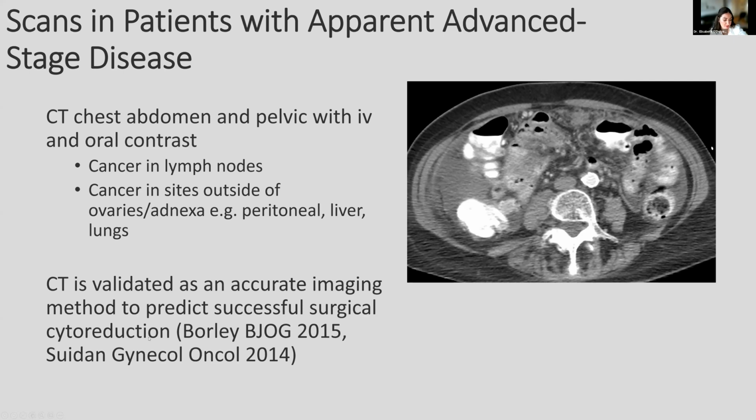And then this US trial also showed a scoring system and a way for us to be predicting it. So it's something that we keep in mind when we're reading cases of patients for staging, and hopefully it can be helpful for our surgeons, if you do that neoadjuvant approach first, so that they have a better idea of where tumor is likely to be and how aggressive they need to be with their debulking.